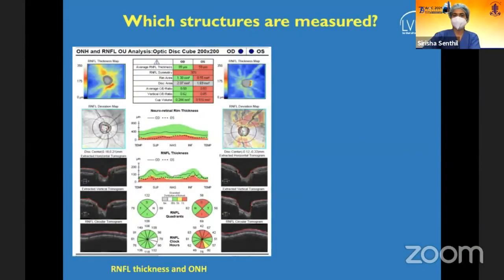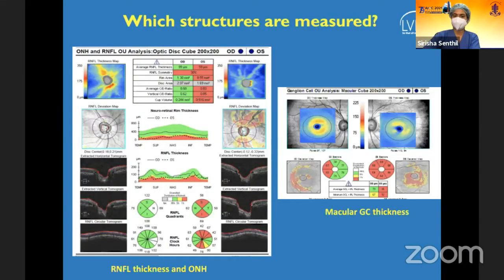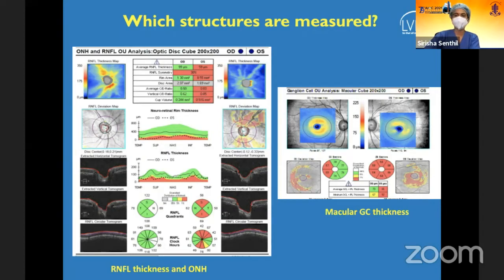The structures measured include retinal nerve fiber layer thickness and optic nerve head changes shown as neuro-retinal rim thickness, along with the RNFL thickness map measured around a measurement circle, providing averages for the superior, nasal, inferior, and temporal sectors and clock-hour maps. Macular GCC is also used because the macular area houses more than 50% of ganglion cells, making it sensitive for early glaucoma detection.